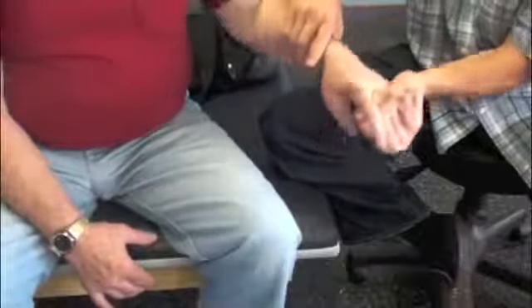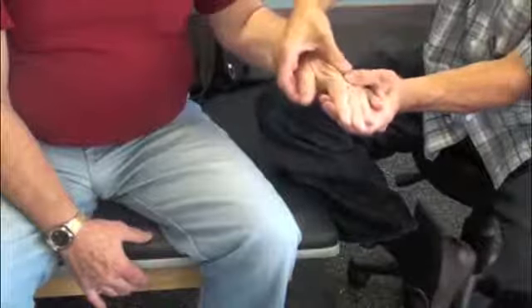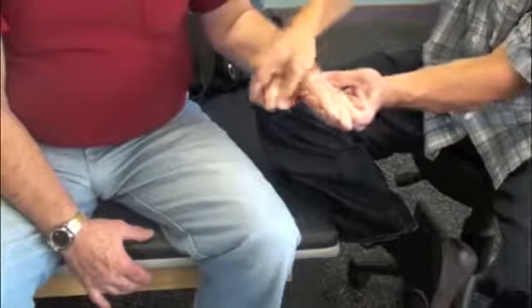In this first example, soft tissue shortening and increased tone is preventing this stroke survivor from qualifying for the SABO Glove.